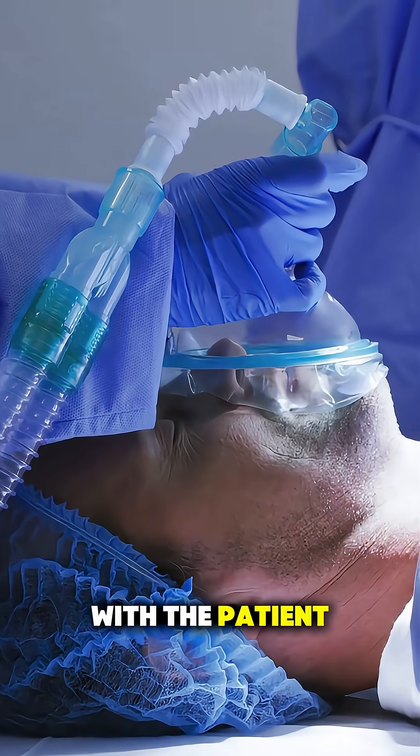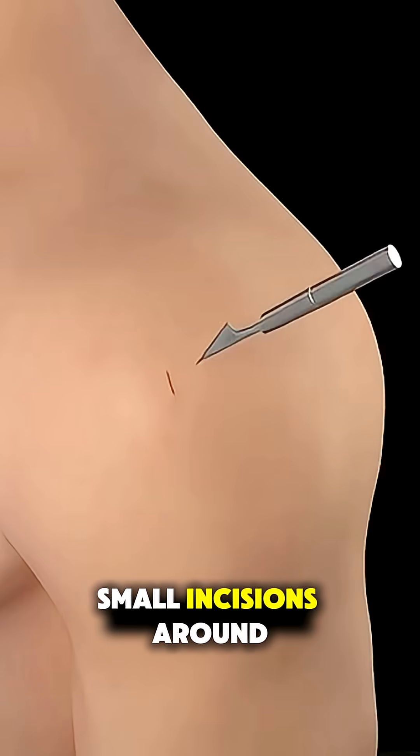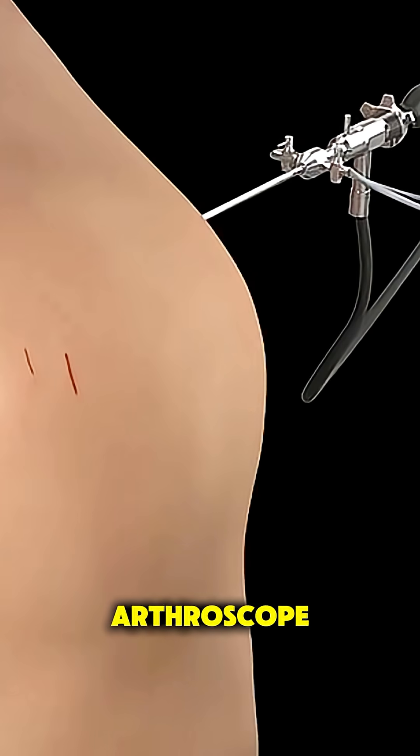The procedure begins with the patient under general anesthesia. Then the surgeon makes a few small incisions around the shoulder and inserts an arthroscope, a tiny camera, to guide the surgery.